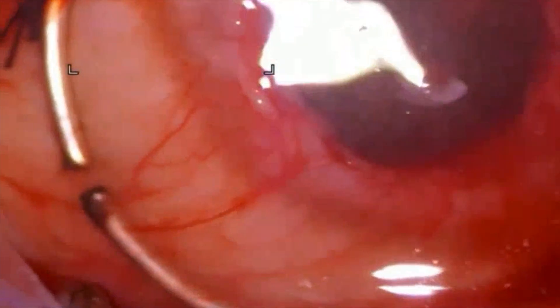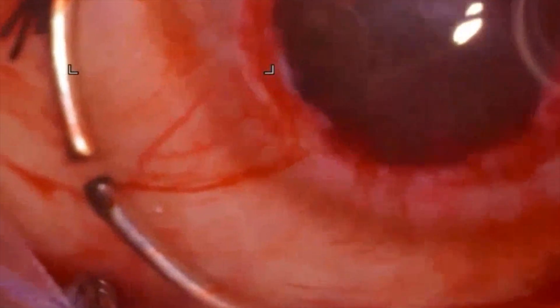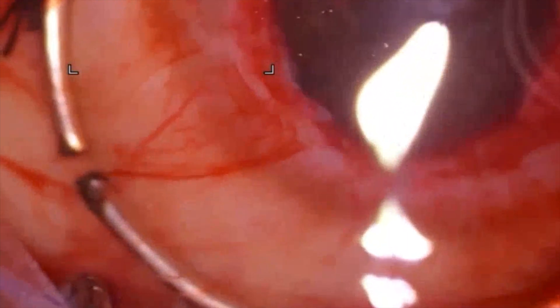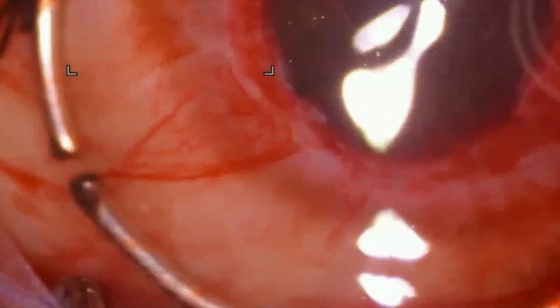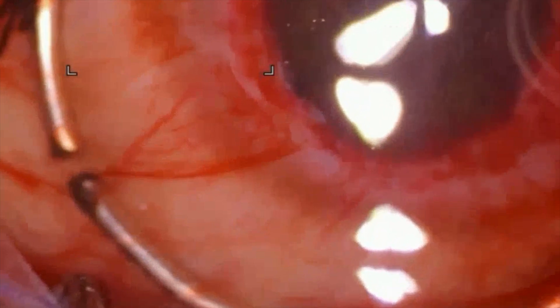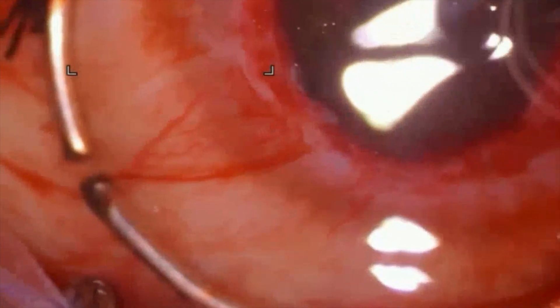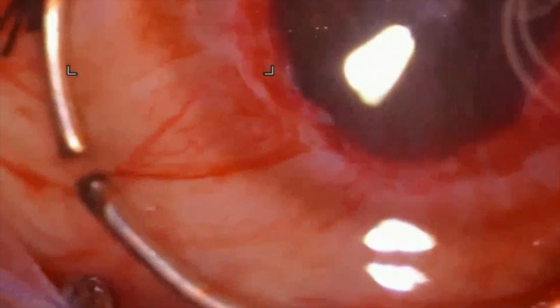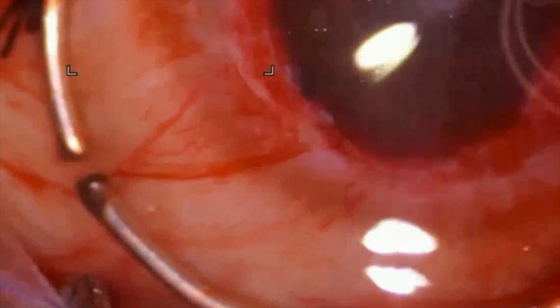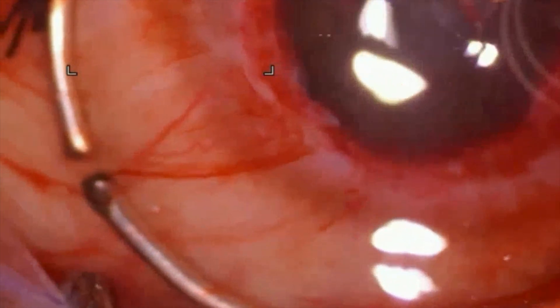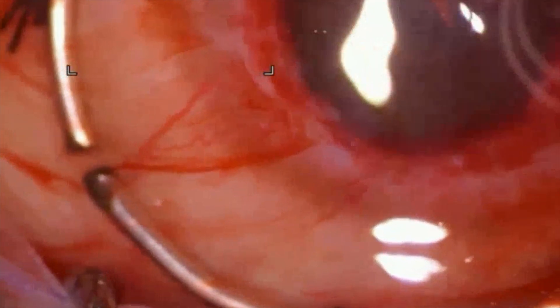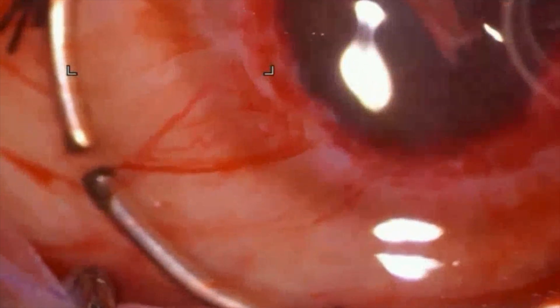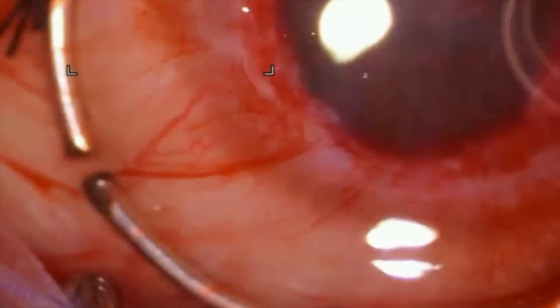The membrane was then carefully dissected, peeling it off from its adhesions and excising it completely. A thin flimsy membrane covered the lens capsule. Any membrane present over the iris or in the pupillary area needs to be excised in a penetrating keratoplasty. Finding the plane of such a membrane is the key to tackling them, especially in a case with an underlying clear lens where care must be taken to avoid damaging the anterior lens capsule.